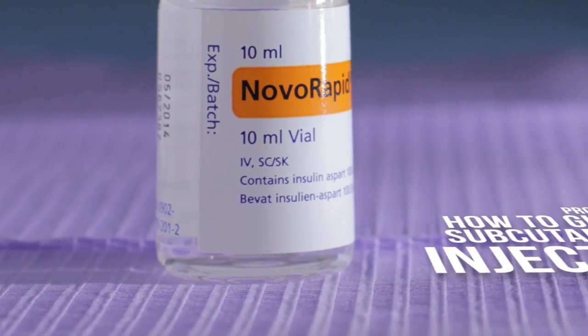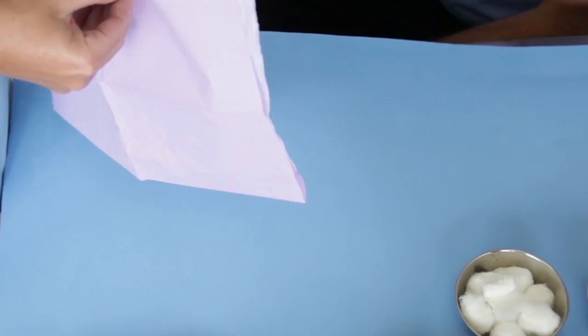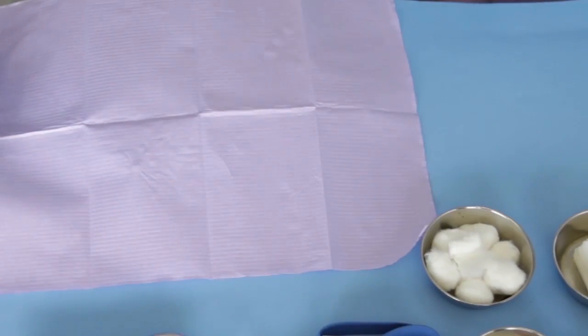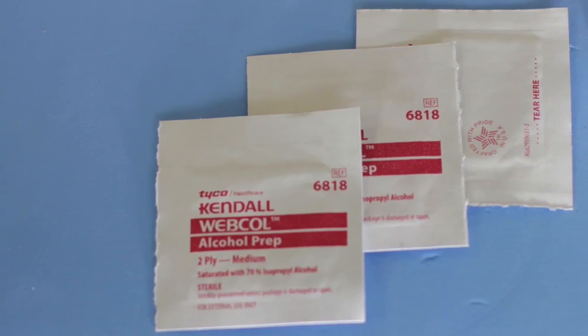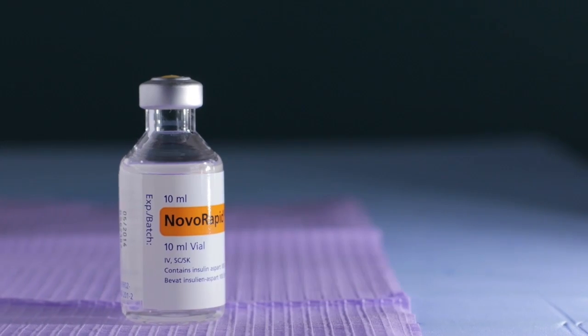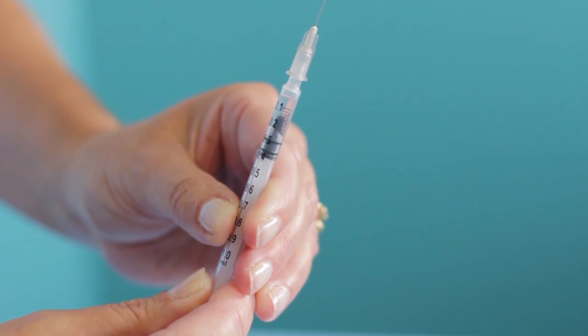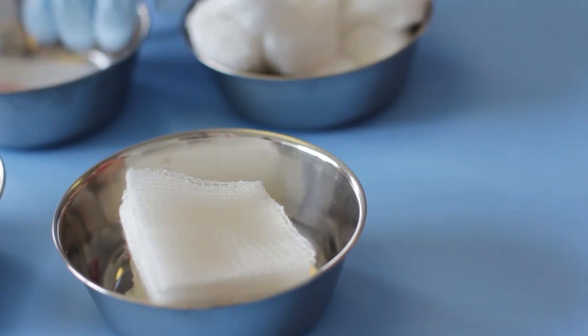Project 8. How to Give a Subcutaneous Injection. You will need the following items: a clean work surface cover, an alcohol wipe, a pair of clean gloves, an ampoule of medication, a small syringe 0.5 milliliters with a 30-gauge needle, and cotton wool or gauze.